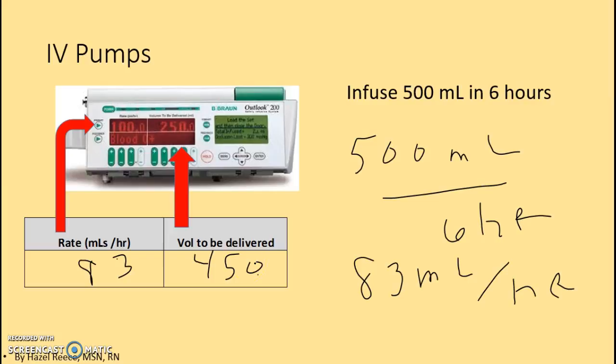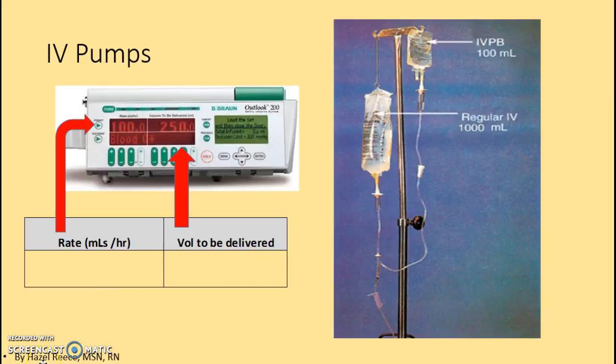Now, just to show you, and you'll see when you play with the one that's in the nursing lab, on this particular model we have these little things that toggle plus or minus signs. So that's how you're going to put your rates in, these numbers. Okay? So now we have a little bit more complicated situation.